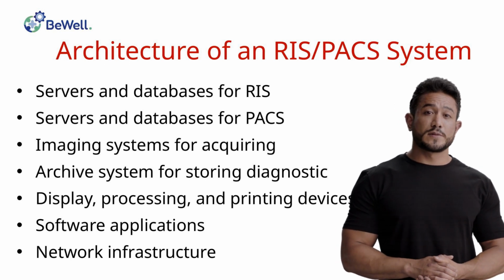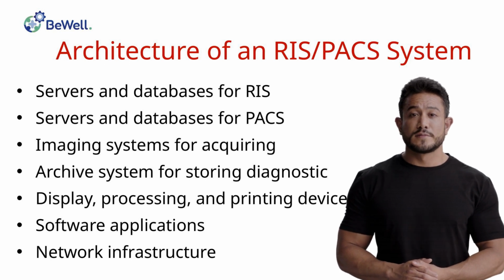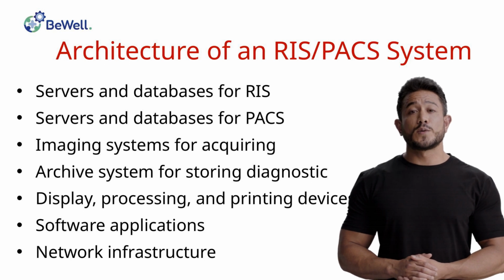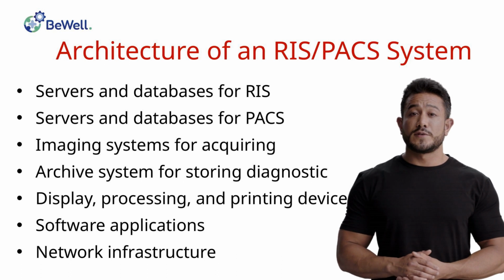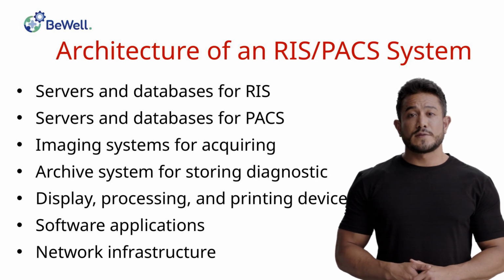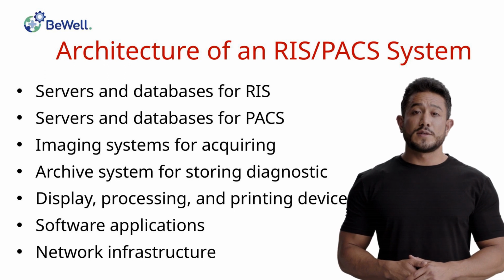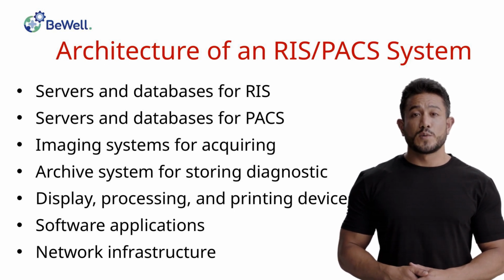Imaging systems, devices for acquiring images from different diagnostic modalities. These are primarily represented by acquisition computers or reporting workstations. Archive system, devices for storing diagnostic images on digital media. Display, processing, and printing devices for images, represented by consultation workstations and their peripherals. Software applications, and network infrastructure.